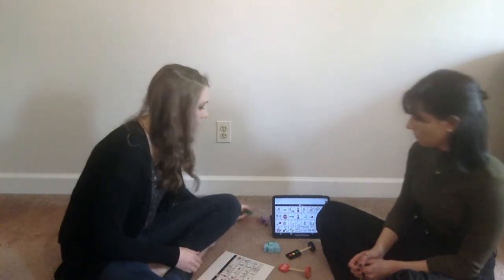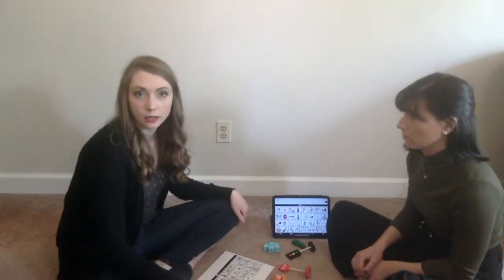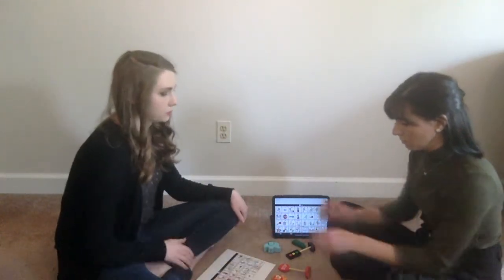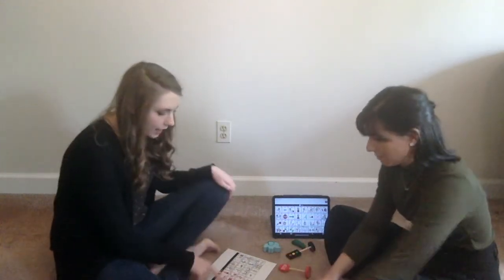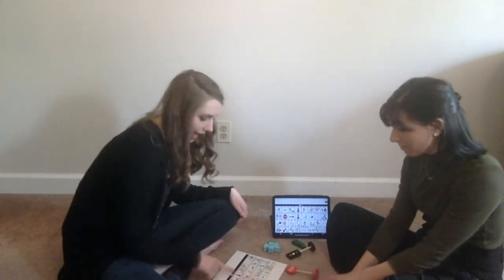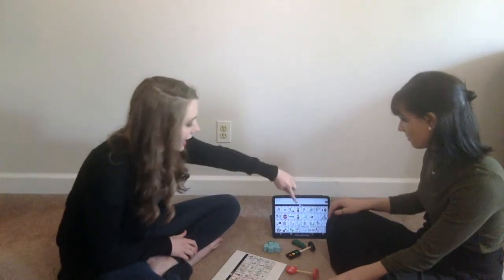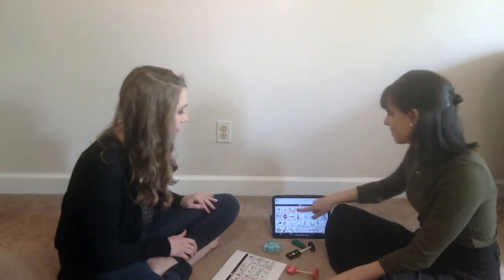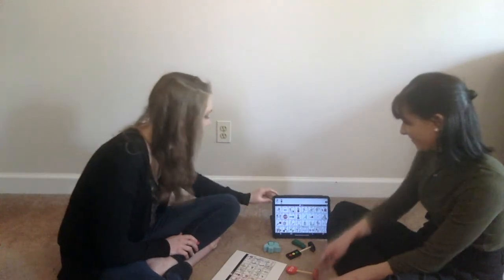So right now, say Alyssa is playing with some toys. And I'm going to be talking about the things that she's doing. So you can play with the toys. Oh, Alyssa, you have a hippo. I like that. You could say, I like that. She says, I like it. Good job, Alyssa.